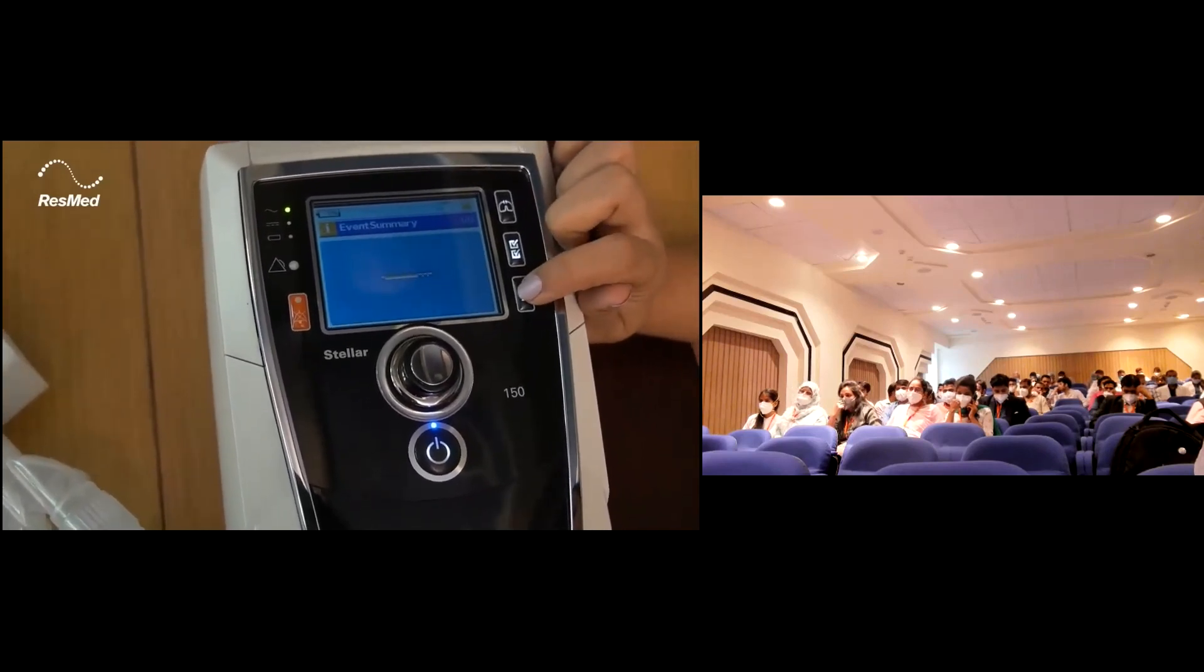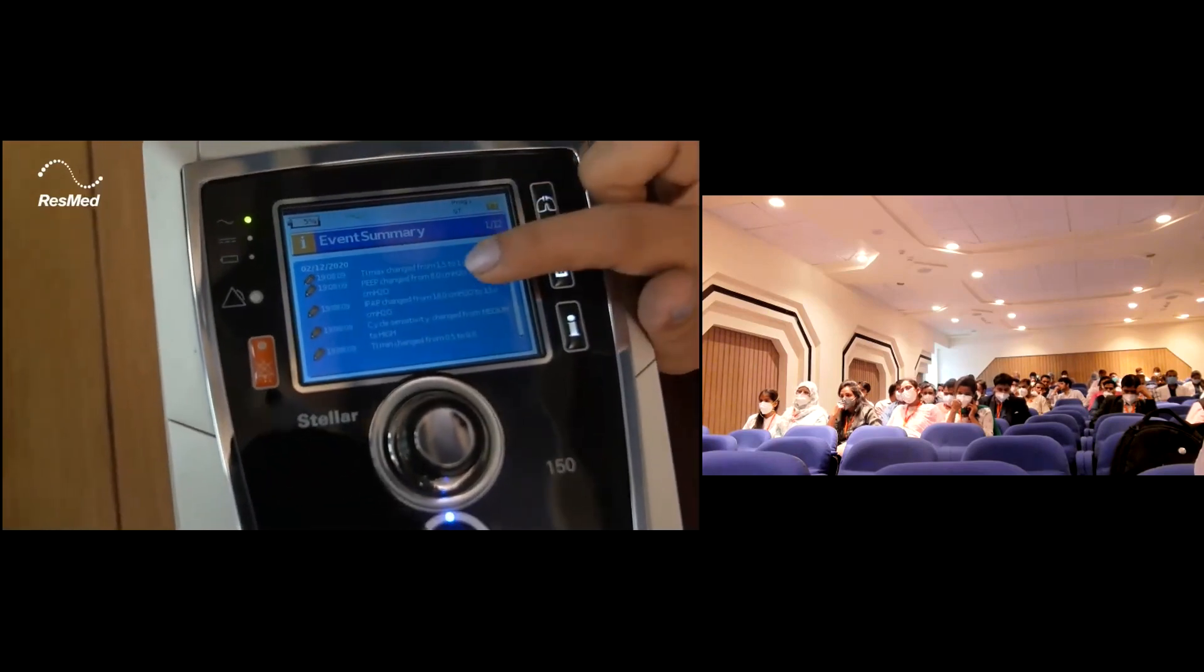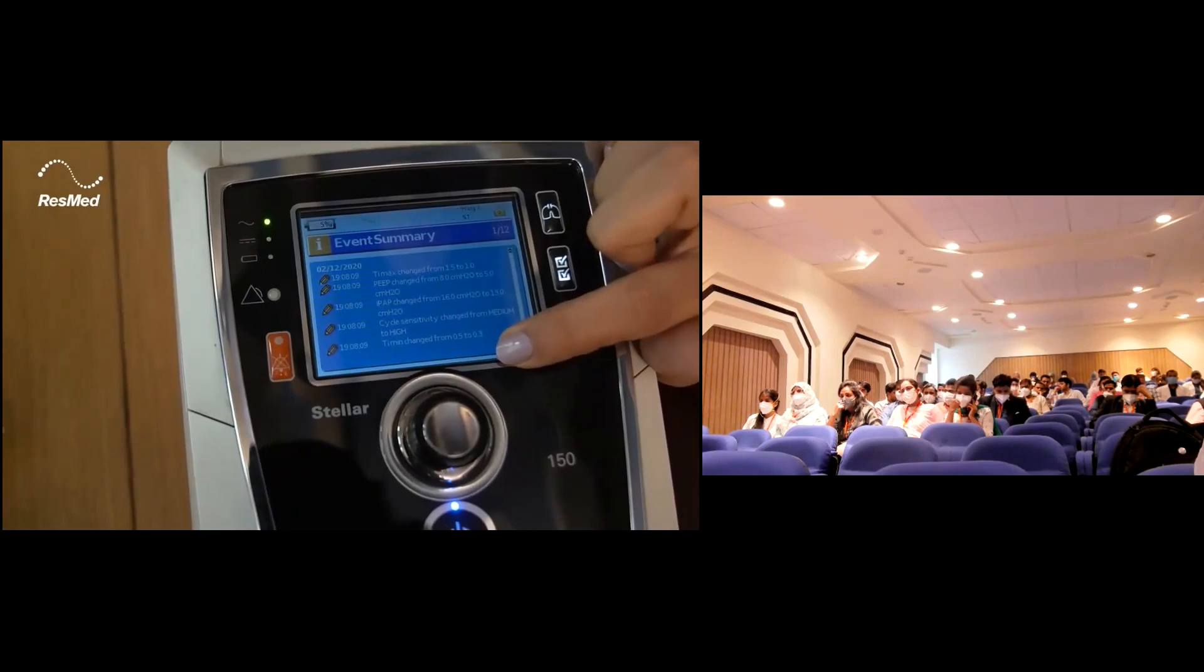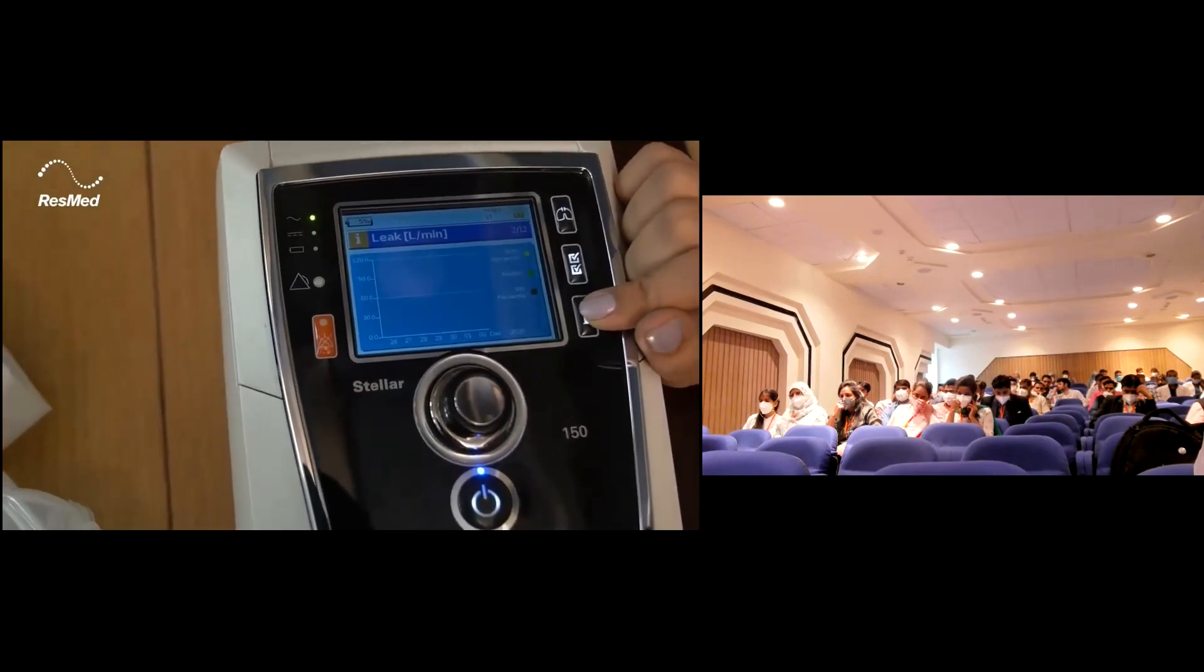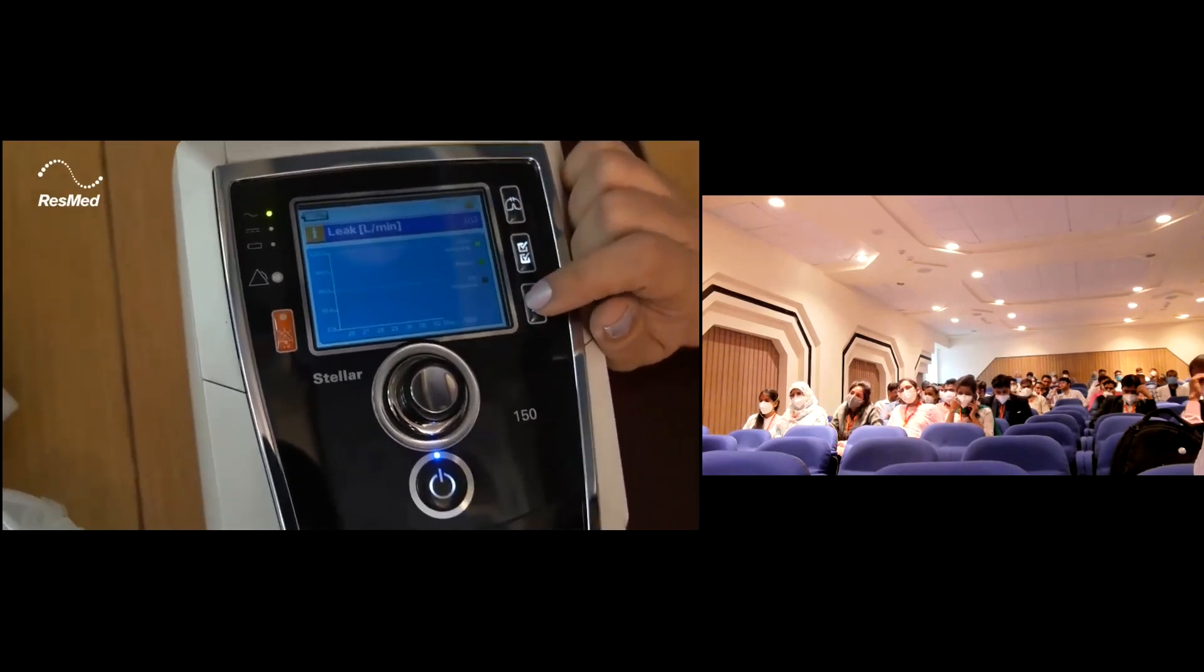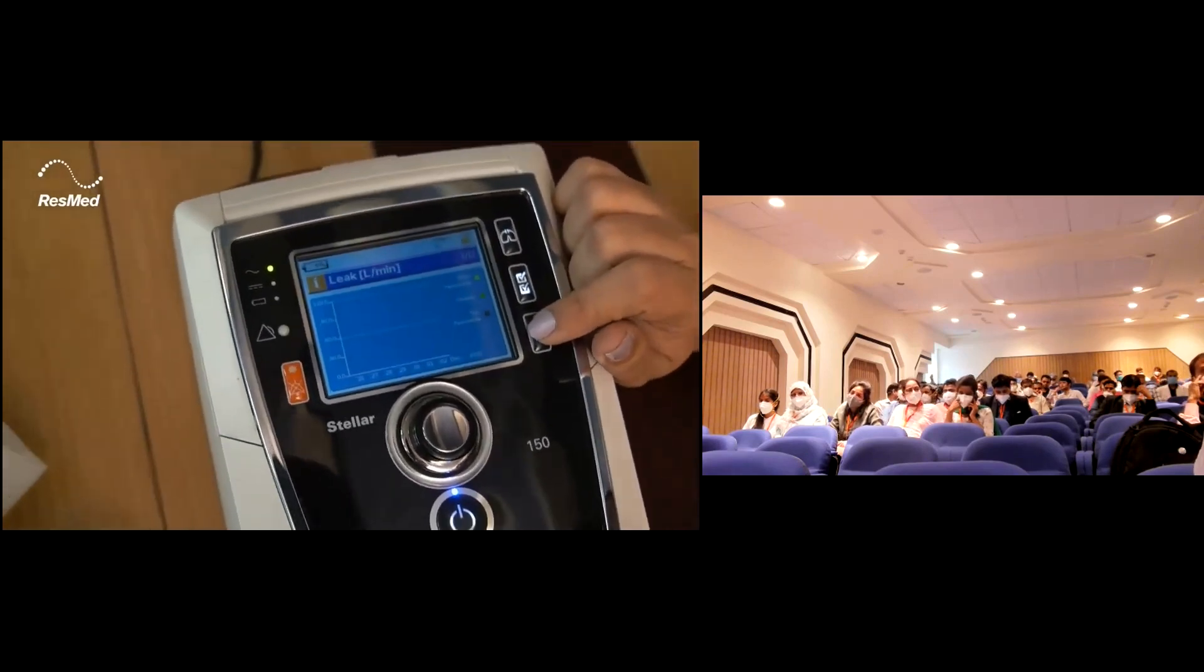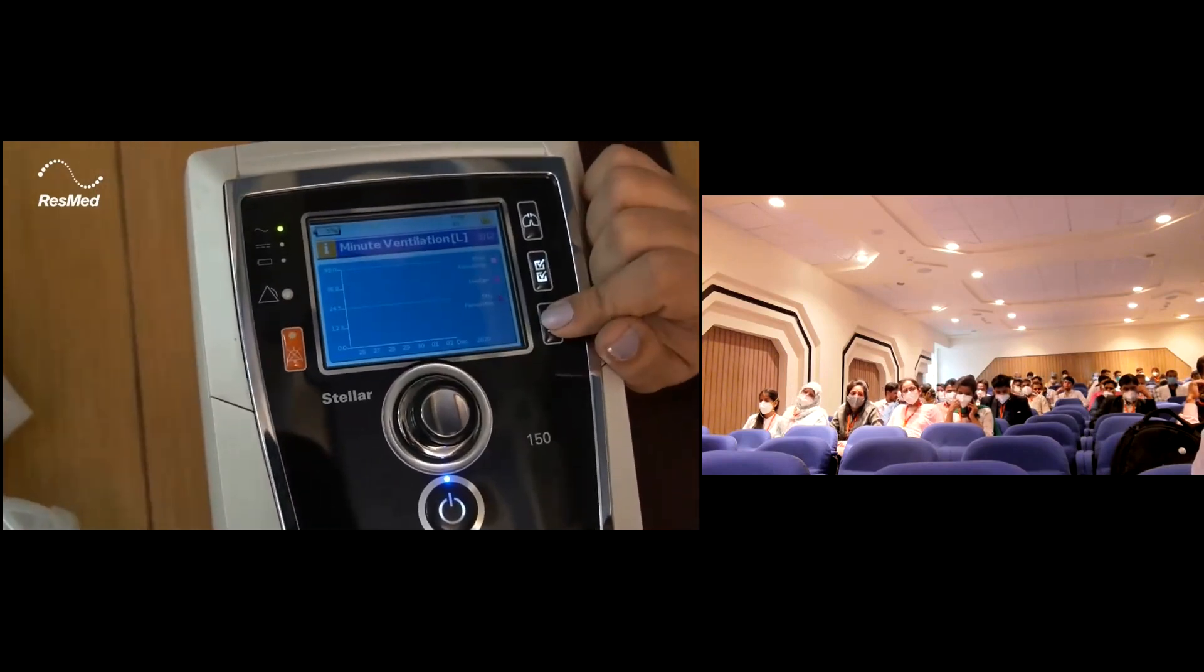Coming to the information menu, you have the event summary. You have 12 pages over here. These are all the events that have happened with the device. When you click again, you go to the next page. You can see what is the leak that the patient had over the last one week.